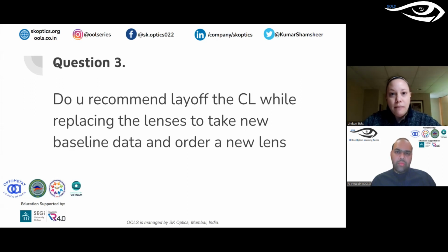I kind of just let the lab default to their preferred or recommended treatment zone based on the overall diameter. But if there is a case where you're not getting enough treatment, you may want to make it larger. Or if you aren't getting enough myopia management, you may change it based on the pupil size. So I think that's something that's coming, more customizable treatment zone diameters like that.